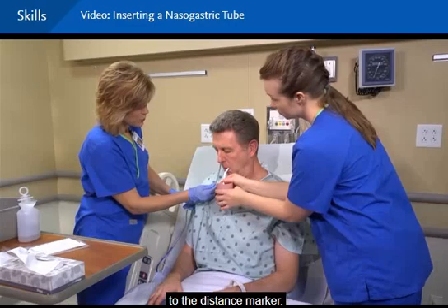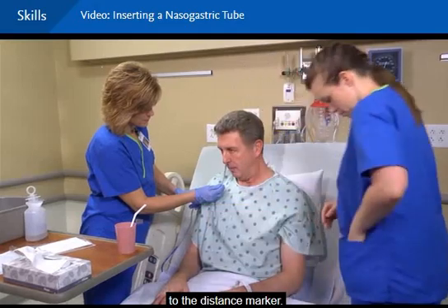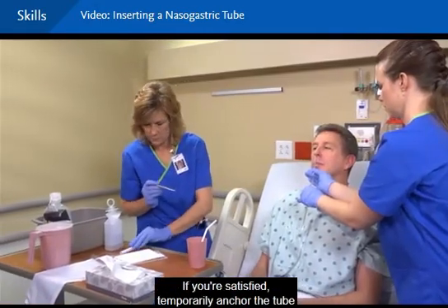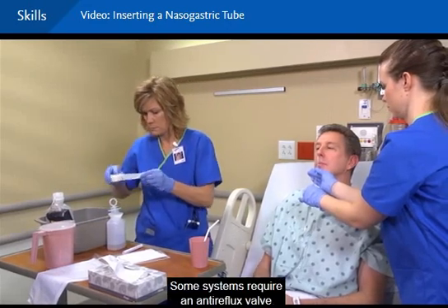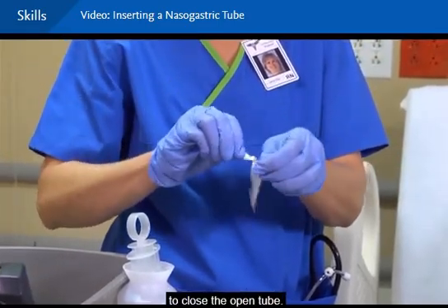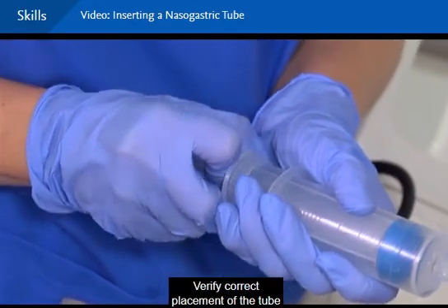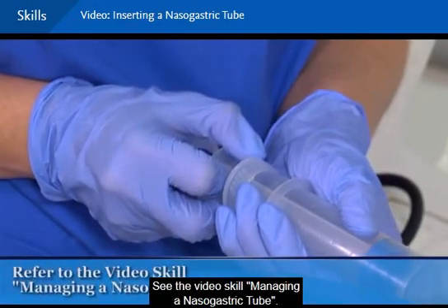All right, Tina, if you could help me hold the tube now, I'd appreciate it, please. Open your mouth, please. Check the position of the tube with a light and tongue blade. If you're satisfied, temporarily anchor the tube to the patient's nose. Some systems require an anti-reflux valve to close the open tube. Verify correct placement of the tube by aspirating stomach contents and checking pH. See the video skill Managing a Nasogastric Tube.